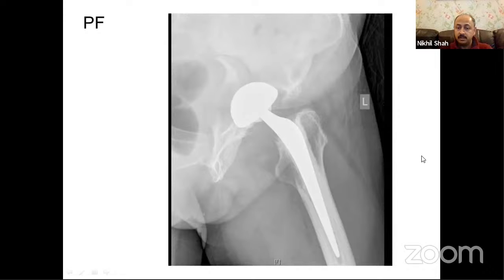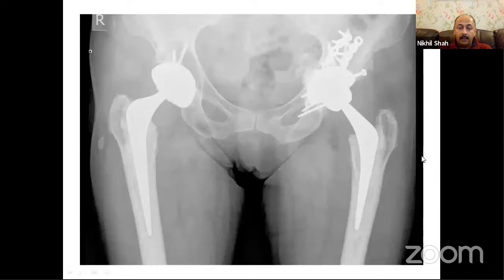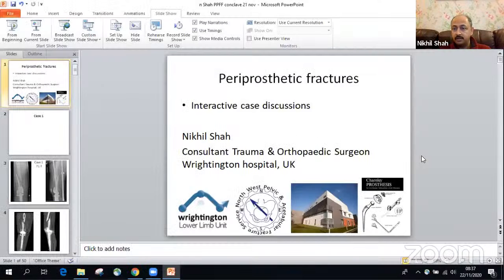The principles in this case are fixation of the columns of the acetabulum using a Kocher-Langenbeck approach, using an anterior retrograde screw from the posterior column to fix your anterior column, and then revise it with a trabecular metal or an ultraporous type cup, a double plate at the back of the column, bone graft for the central floor, which is quite deficient in these cases. And you can see the anterior screw that has been passed from the retrograde. And she's coming on nearly to 6 to 7 years now of follow-up. So that's it really. Those were the cases that I had. And I hope that they illustrate the point that Sanchit made.